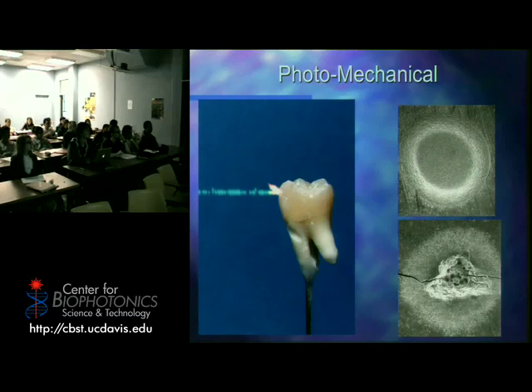But if I happen to have the thing cranked up a little too high, or I make the pulse too long, and I deposit too much energy, I can have this happen. I've deposited so much energy that the enamel of the tooth cracks.